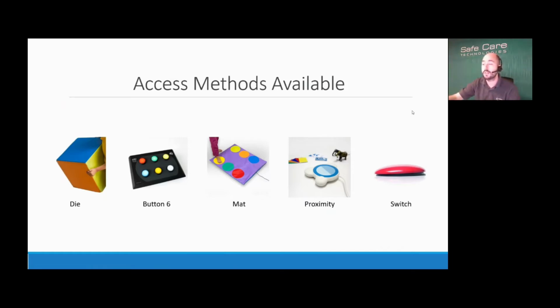And what it does is you stick this little sticker that you get when you purchase the proximity to the bottom of the toy. So for example, if we were working on animals, is this an elephant? Is this a dog? Is this a cat, for example? We can put the little sticker on the bottom of the elephant, place that elephant onto the top of the blue sensor that you see from the image, and then that will actually bring us to the system.